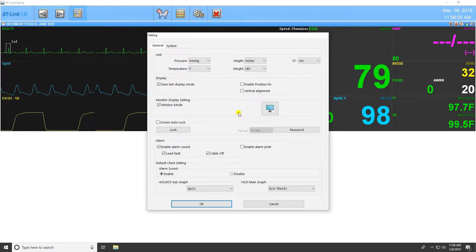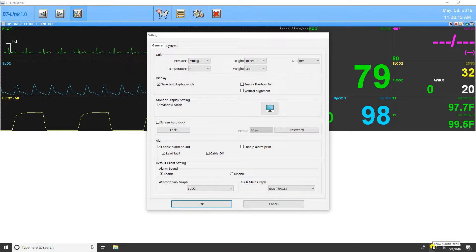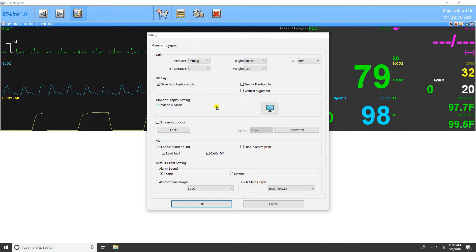Be advised, when using windowed mode, the program will be sent to the system tray in the lower right-hand corner of the taskbar. To maximize the program again, simply double-click on the BT-Link icon in the system tray.